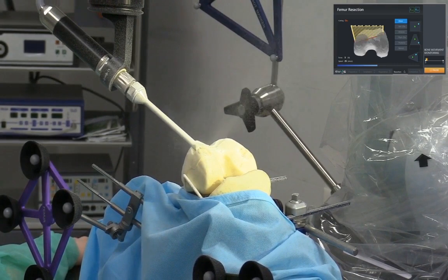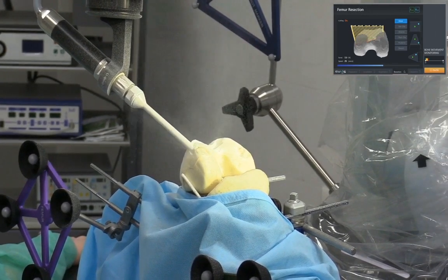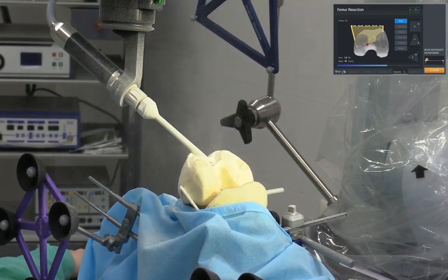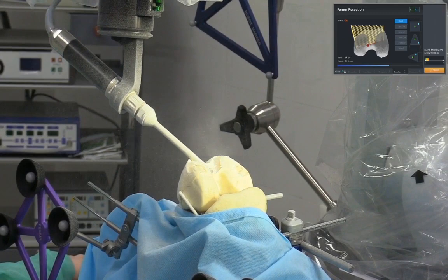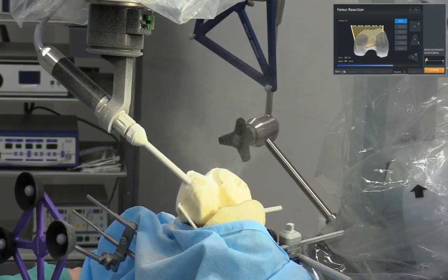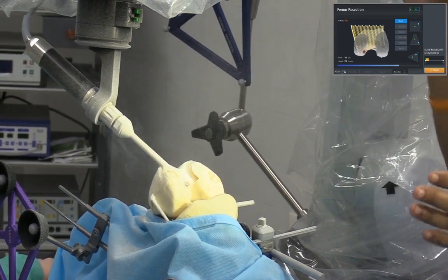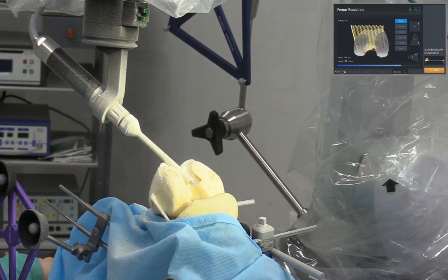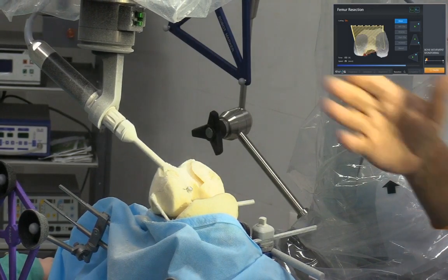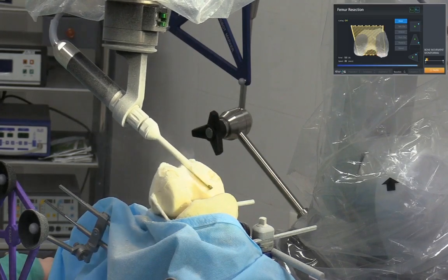And also there is irrigation which happens. With continuous irrigation, there is no risk of any bone necrosis. Having said that, on the screen at the bottom right, you can see that there is one bar which is advancing continuously. This is called bone movement monitoring. In case there is any relative movement between the robotic arm and the knee joint, the arm is just going to stop cutting. The maximum limit is 0 to 3. If it exceeds, then the cutting operation quickly stops. And the response time to stop is just 0.01 second.